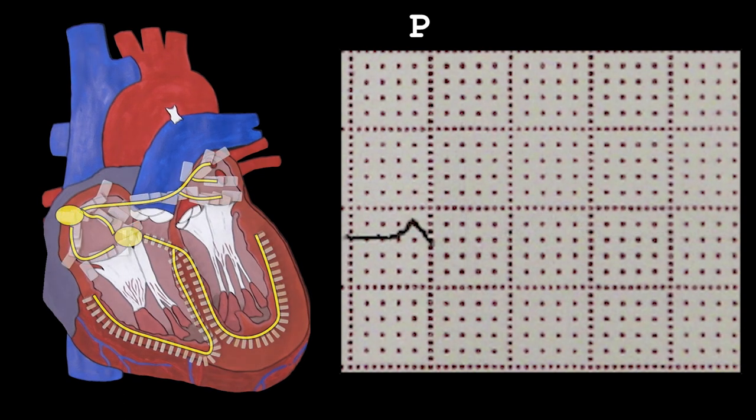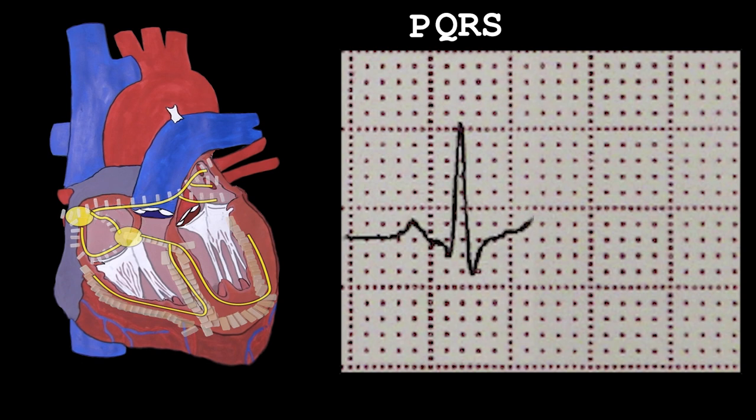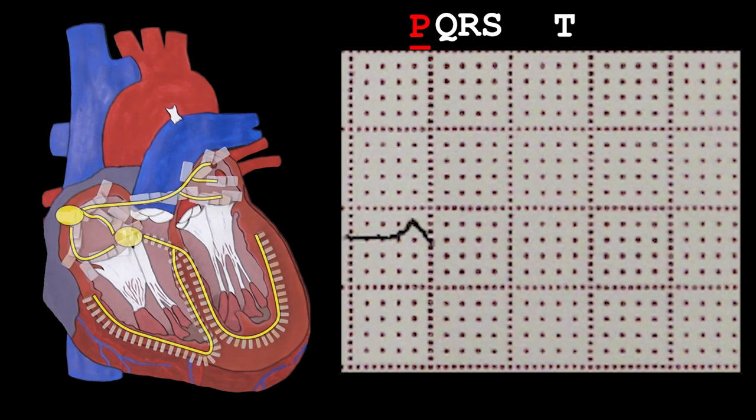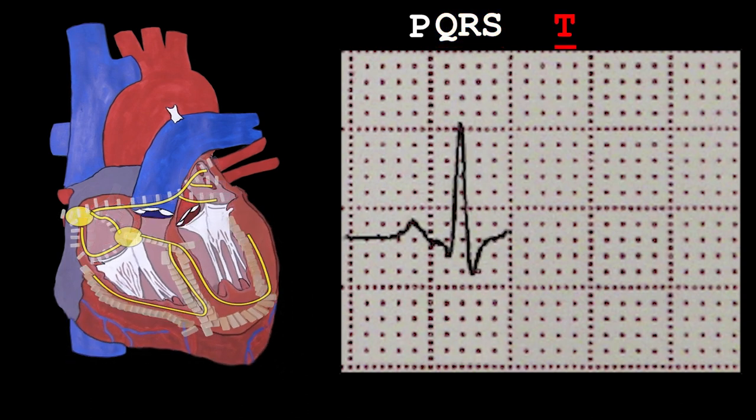P wave, QRS complex, T wave, atrial depolarization, ventricular depolarization, ventricular repolarization.